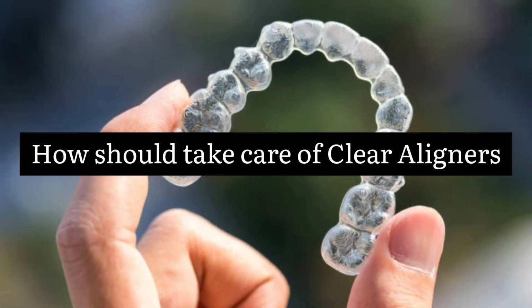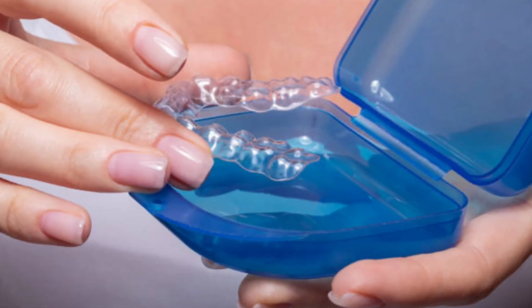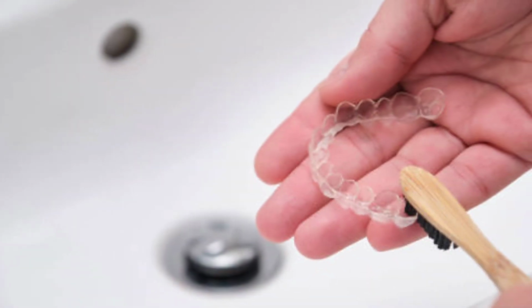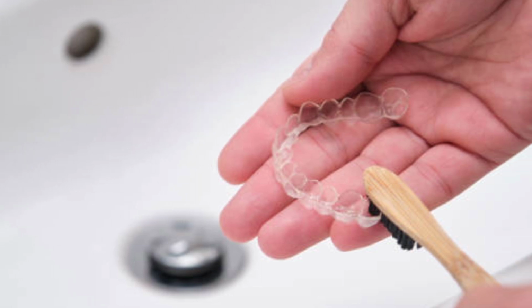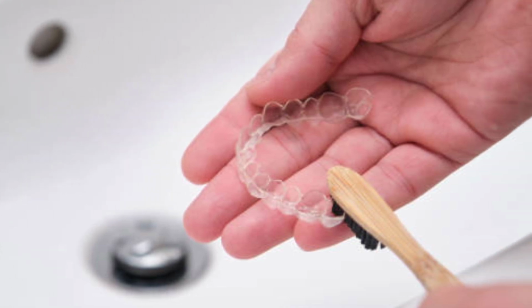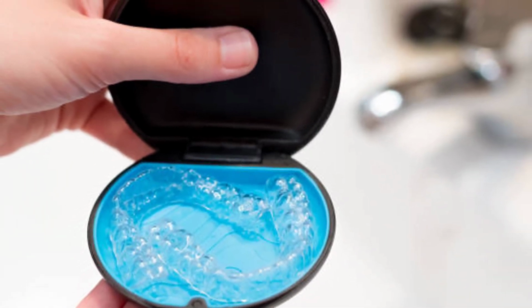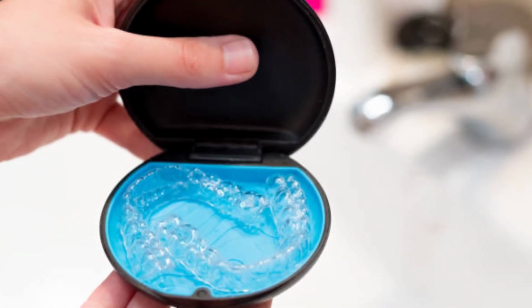How should we take care of clear aligners? You should remove your aligner while brushing, flossing and eating. Keep your aligners clean. While you brush, make sure that you brush your aligner in the same way. Keep them safe in the box given by your orthodontist to prevent them from getting dirty.